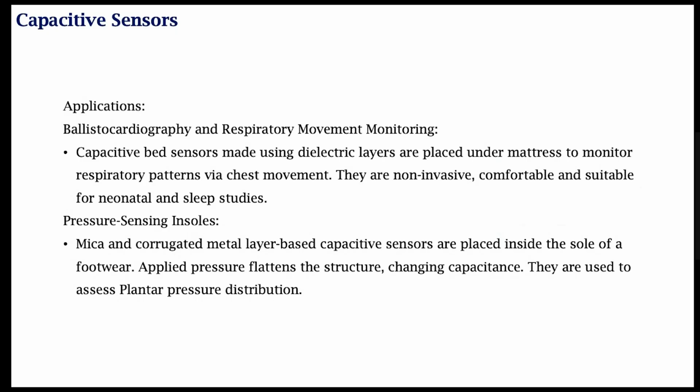Because an ICU patient is likely to have many such sensors placed on their body, you cannot place one more sensor that is going to measure respiratory rate, but we are interested in measuring respiratory rate. So that is where design comes in. Design consideration should include all such considerations. So these capacitive sensors that are placed below the bed are relatively comfortable and absolutely non-intrusive, not just non-invasive, but also non-intrusive.